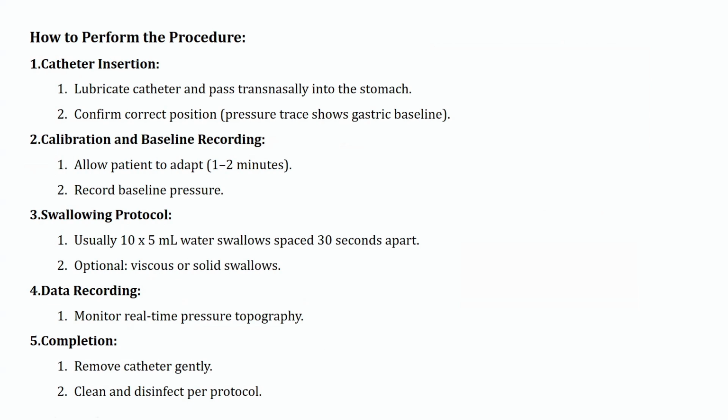It should be a very little amount of spray or gel, because we don't want anything to affect the motility or swallowing, since we are going to give the patient water to drink during the procedure. If there is any anesthesia that affects swallowing, maybe it will cause aspiration. So I prefer to first try to insert without anesthesia, without any spray, just lubricant gel. And from my experience, 98% are done without anesthesia, just with lubricant gel.